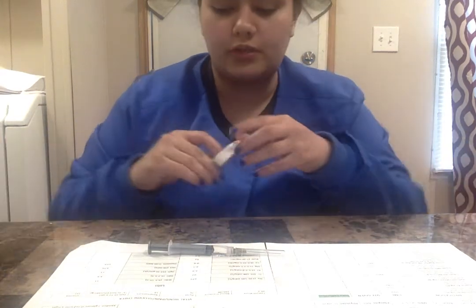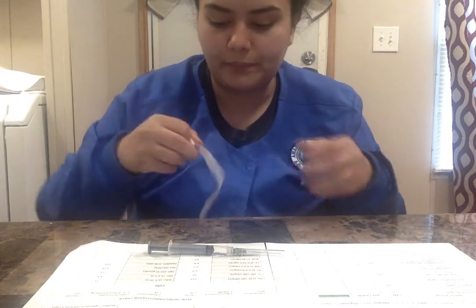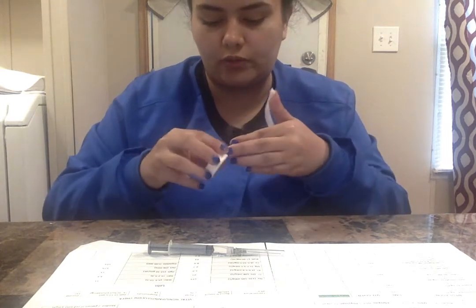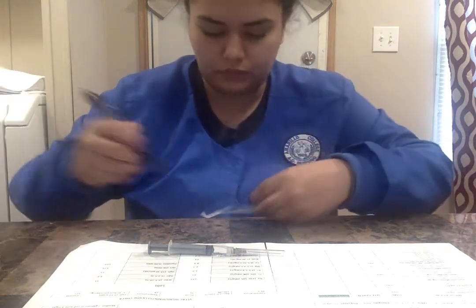So next, what we're going to do is we're going to get our tape. We are going to label our hydromorphone.